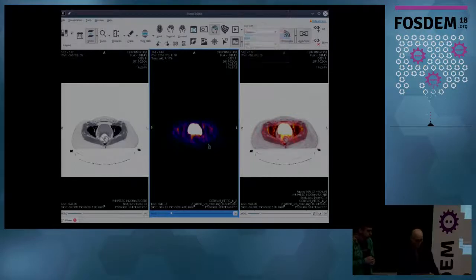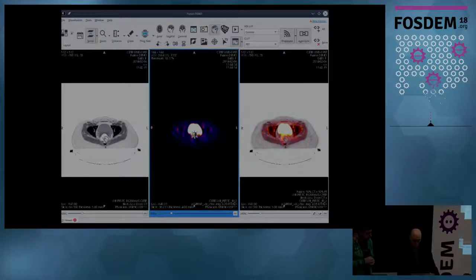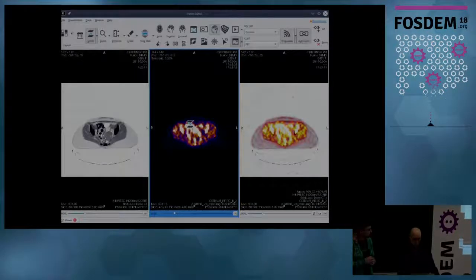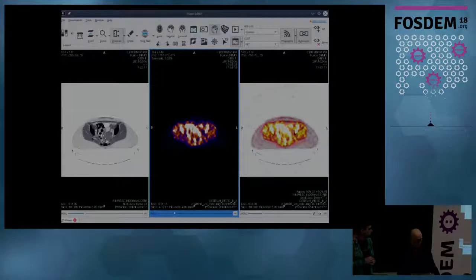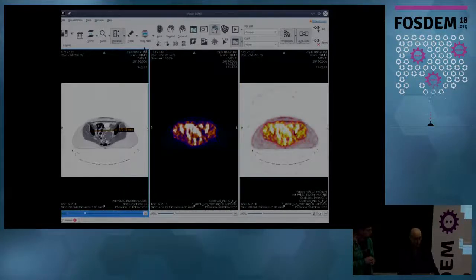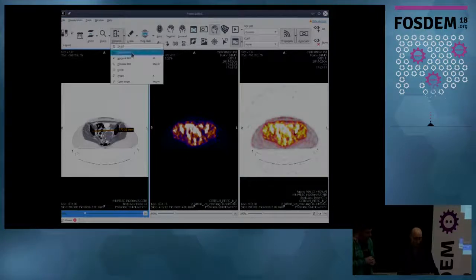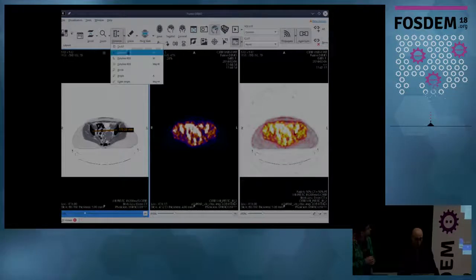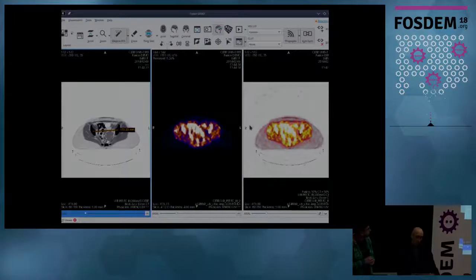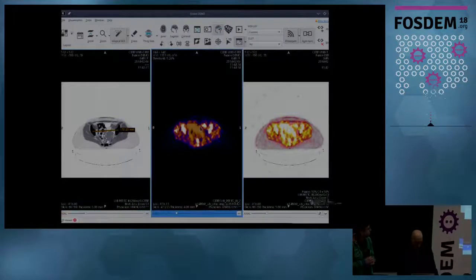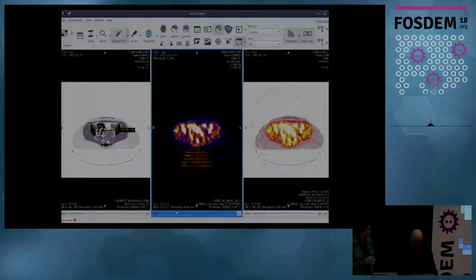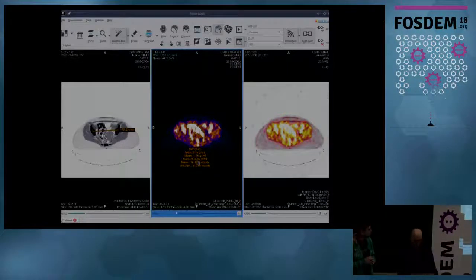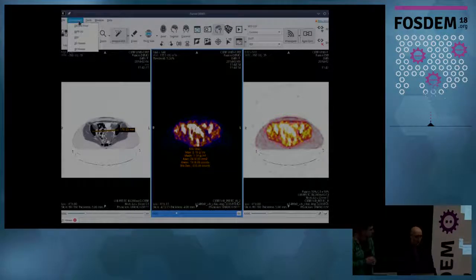Here, I can change the color, for example, of this representation. And now it uses a different color scale. What we can also do is doing measurements. For example, I can measure the distance from here to here, or I can do the calculation of several statistic values with a region growing technique, like here. And it gives technical information we won't explain now.